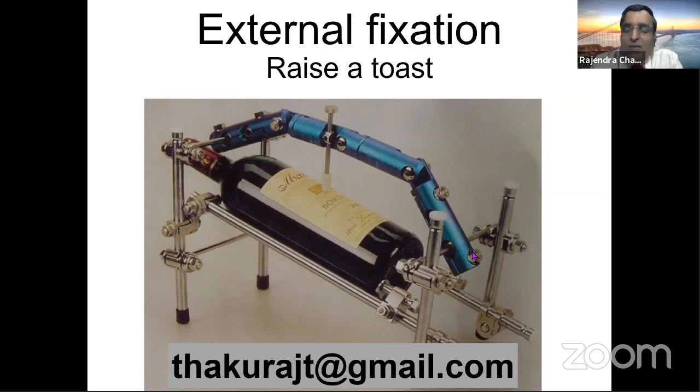Okay. But is the use of external fixator really valuable in all compound fracture management? Yes, sir. As an initial span, scan and plan philosophy, yes, that is really useful. Learning about integrity, putting pins, stabilizing the fracture, getting the distraction, getting into a stable mode, allowing for soft tissue procedures are the real advantages.